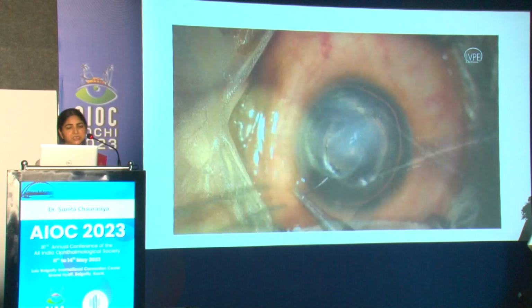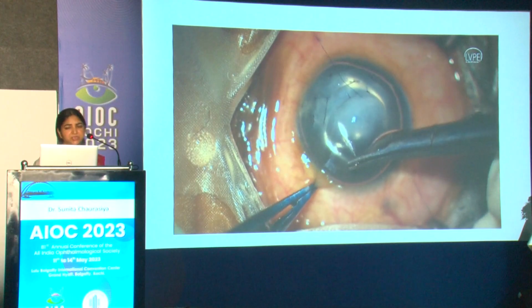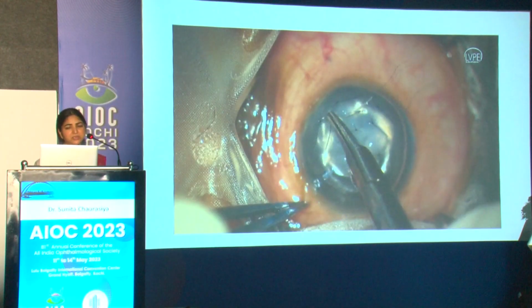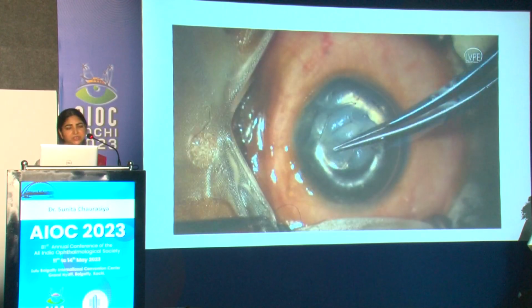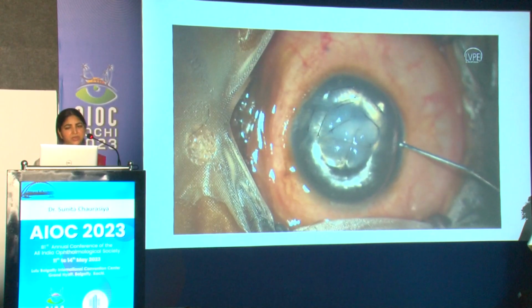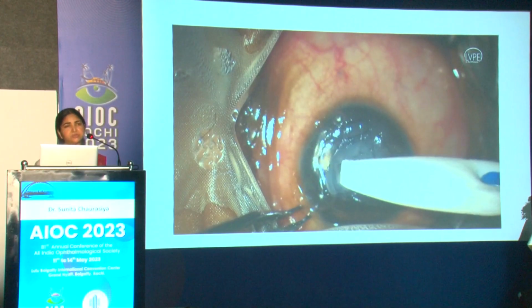This is important to understand where the posterior membrane is, so that when you pass the sutures, you have an idea about it. And these sutures are partial thickness. They are not full thickness through and through. They are just partial thickness within the stroma to create a compression or an indentation effect on the surface. And the air bubble provides guidance as to what level we are at.